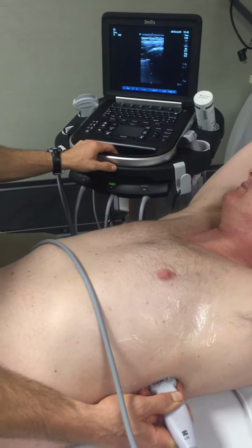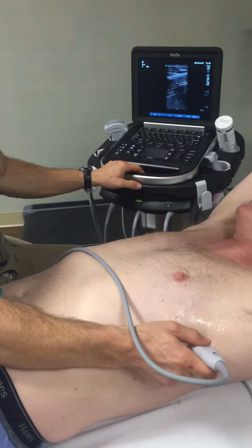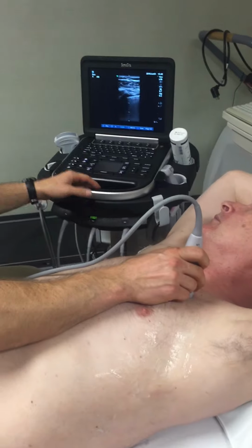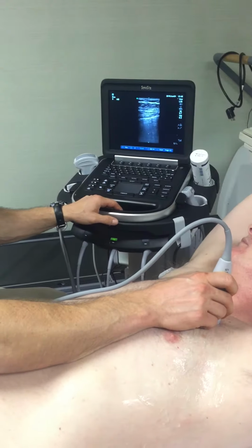So to review, there's 4 stages or positions. Posteriorly, there's 2, and then anteriorly, there's 2 as well. If it's just pneumothorax you're looking at, you just look anteriorly, and then you can use M mode as needed.